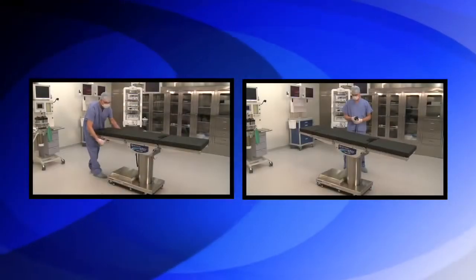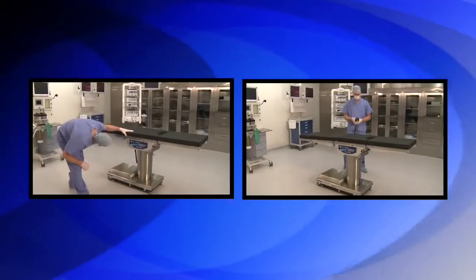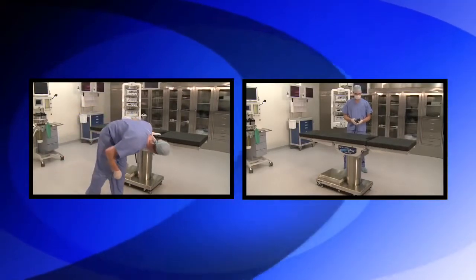In addition, prior to placing a patient onto the surgical table, operating room personnel should inspect the table each day to ensure it is functioning properly.